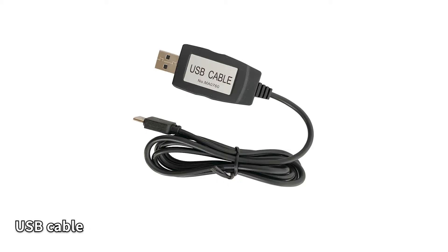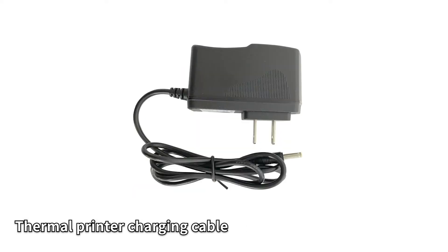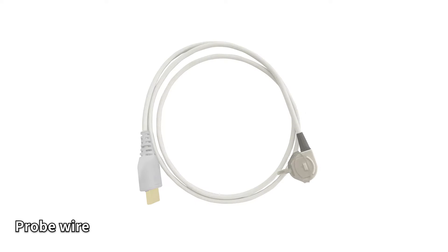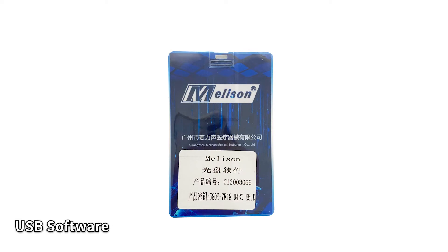Mars Zero One accessories introduction: USB cable, charger, thermal printer charging cable, thermal printer, probe wire, earplugs, calibration gun, and USB software.